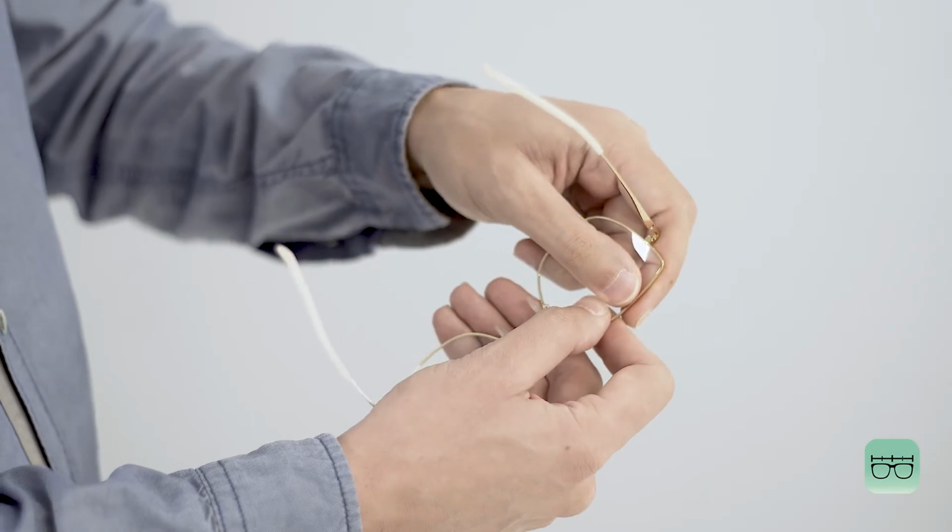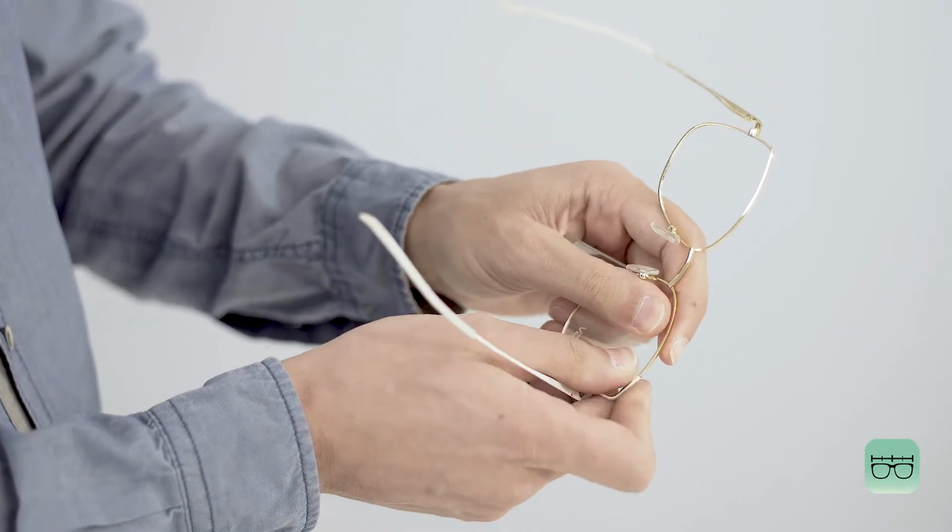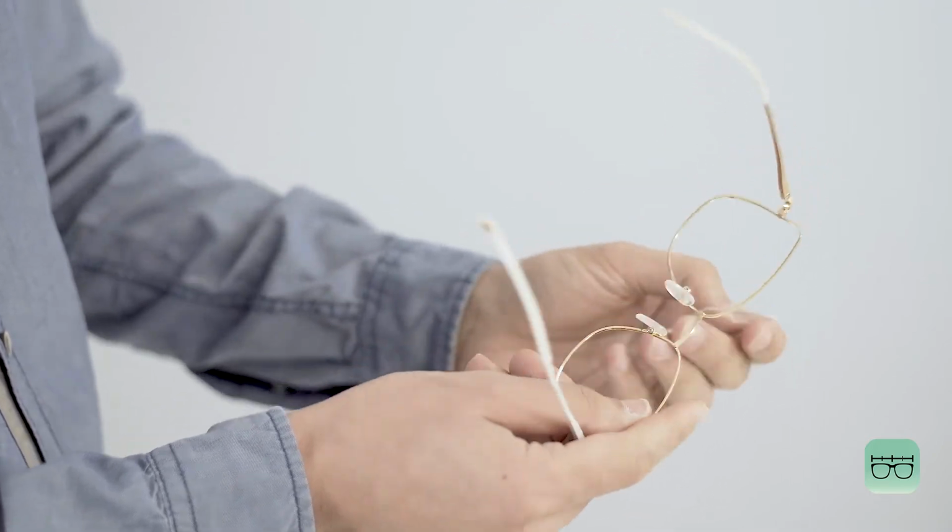To capture a clear picture of the eyes, if possible, remove the demo lens from the frame. The frame is placed in the right place by the patient himself with our guidance, then the measuring device is placed correctly on the frame.